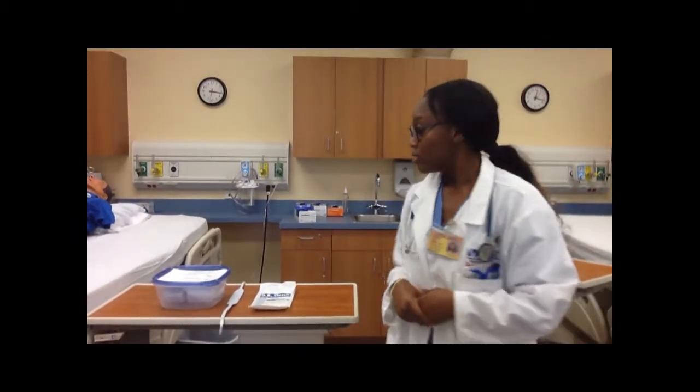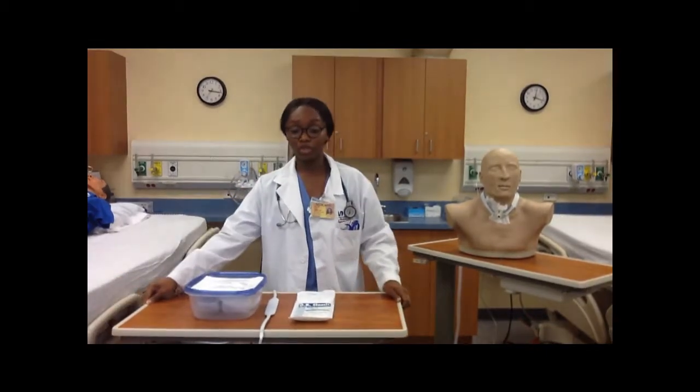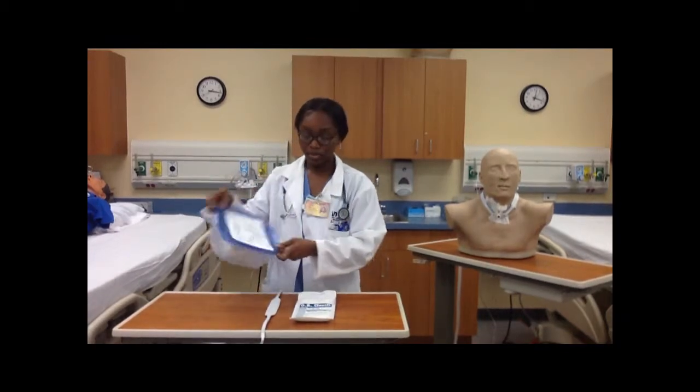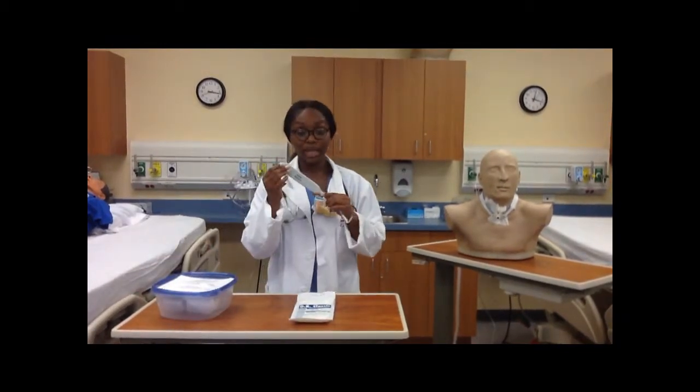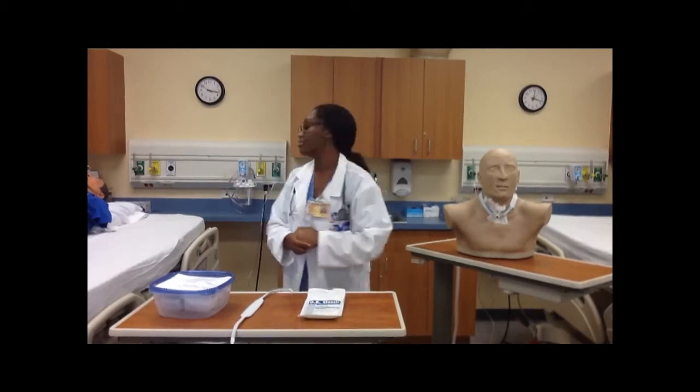Now, you have to have all your necessary equipment in order to perform trach care. You need your tracheostomy clean and care tray. You need your Velcro necktie. And you also need your sterile gloves. But before I get started, I'm just going to step over here and wash my hands and don the proper PPE.